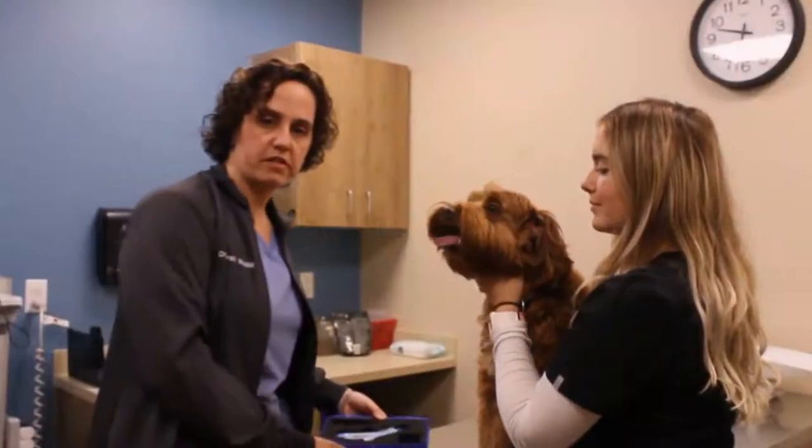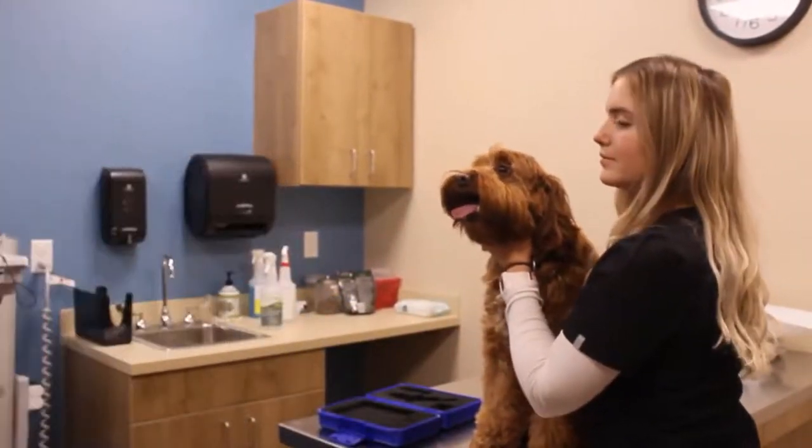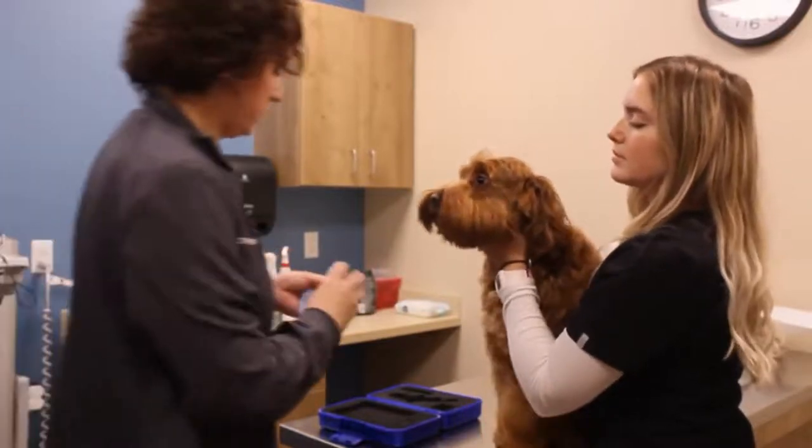Next we're going to measure his eye pressure. This is a test for glaucoma. We first give them drops to numb their eye.